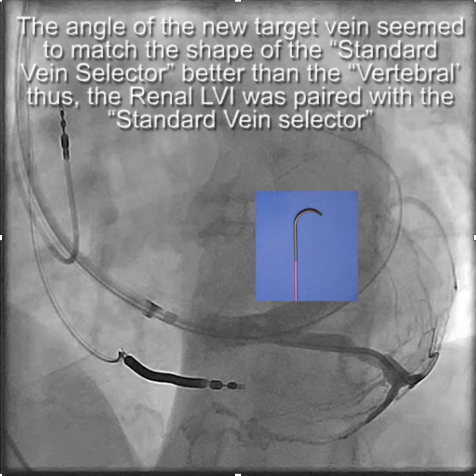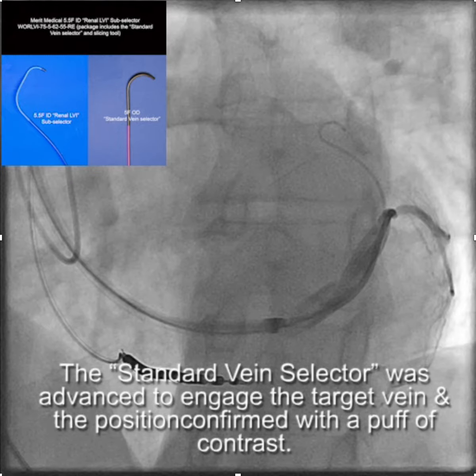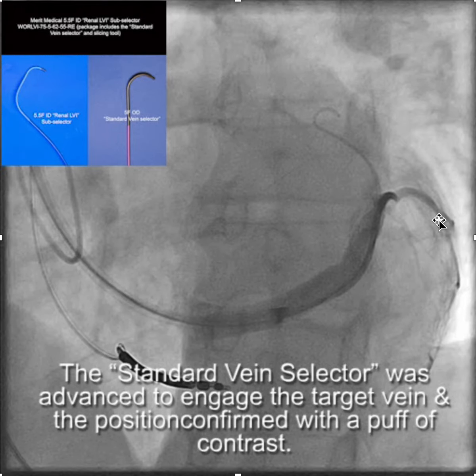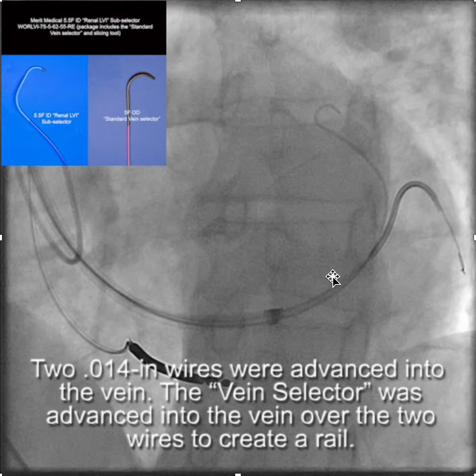Here you can see we've engaged the branch and injected contrast to confirm we're in the branch. We're also identifying side branches that we might want to put the lead down, and we chose the larger of the two and put two 0.014-inch wires into the vein.